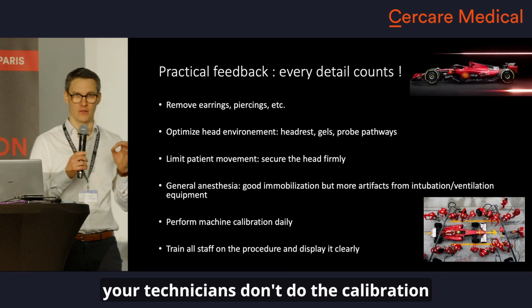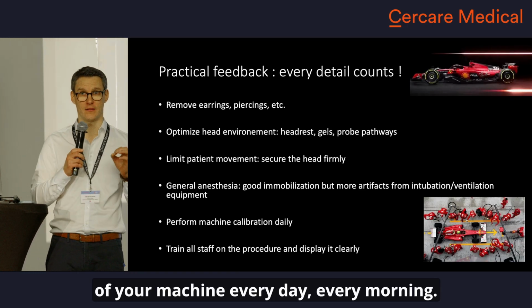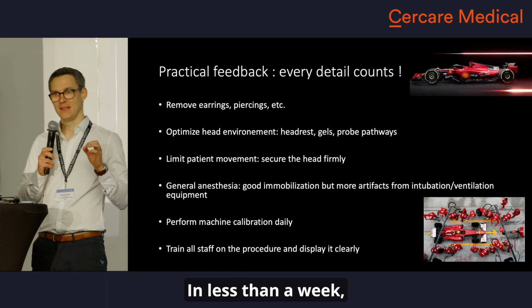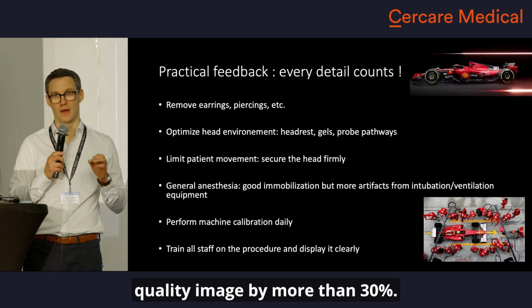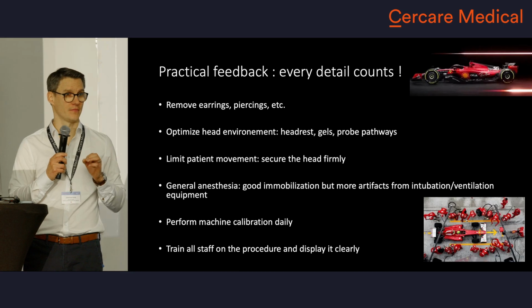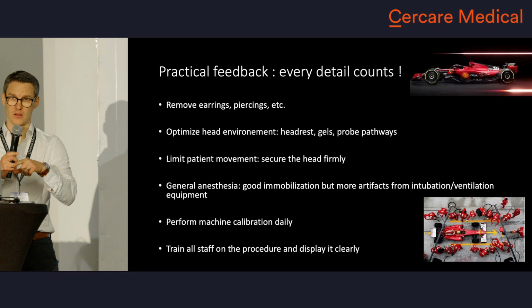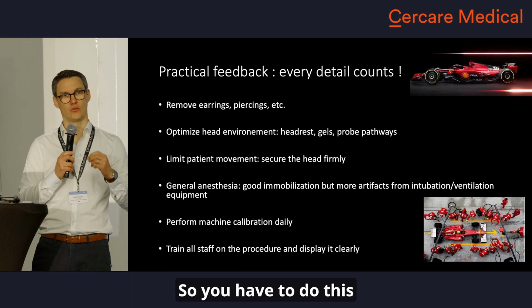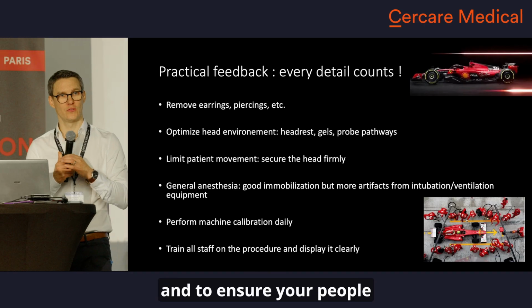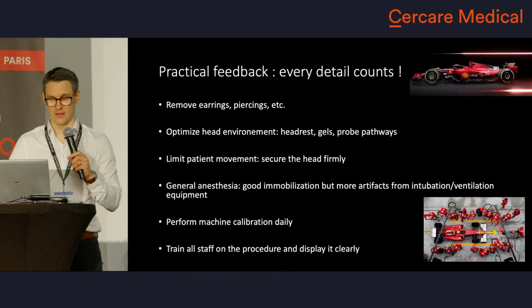And then something I can just talk about for Philips, but we've observed that if your technicians don't do the calibration of your machine every day, every morning, in less than a week, you can decrease your CBCT image quality by more than 30%. You got some artifacts coming, linear artifacts like you saw. Sometimes it's a target artifact in the middle of the scan. So you have to ensure your people absolutely do the calibration every day.